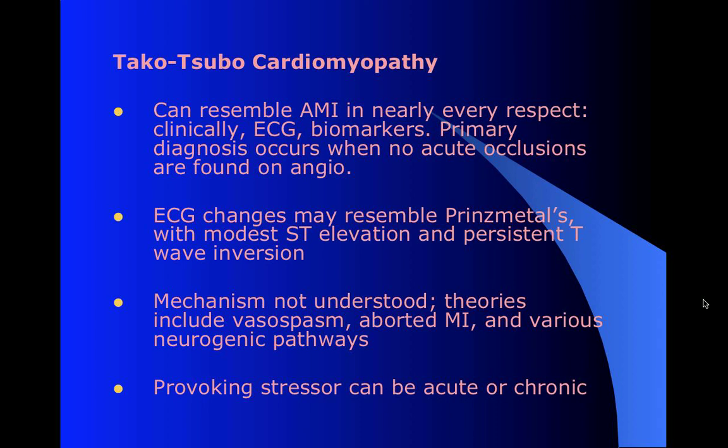In general, it may look like Prinzmetals with maybe a little bit of elevation, kind of those funky inverted T waves. That's not uncommon. But it's not totally understood. Like I said, it's felt to be some sort of vasospasm, maybe through a catecholamine response, much like in those head injuries. Really a similar, at least theorized mechanism.